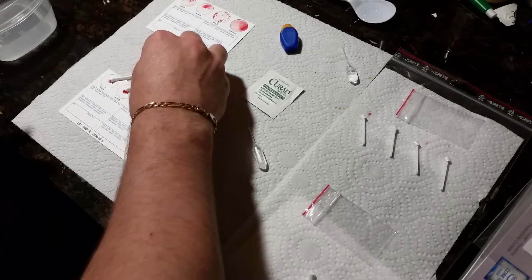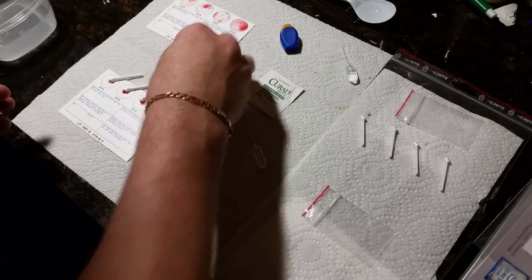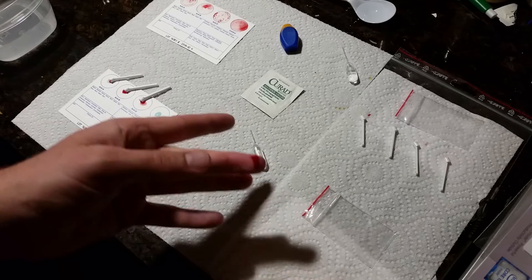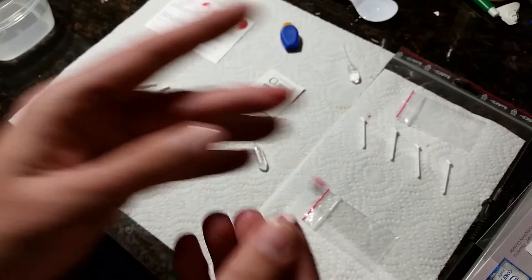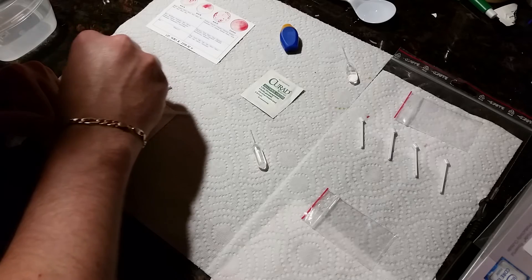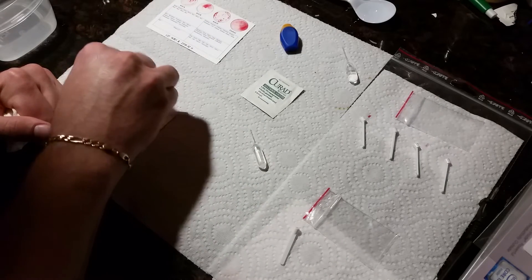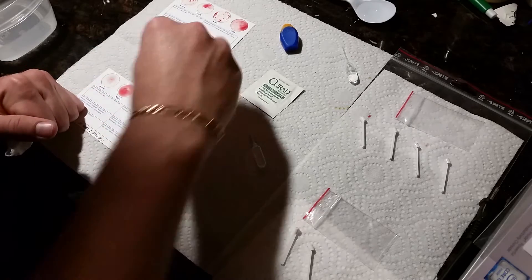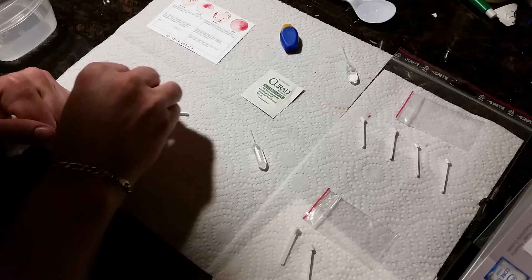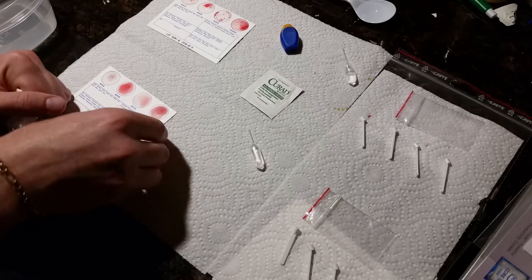Try not to breathe on your surface area, do not cough on your surface area — keep it as clean as possible. This stuff comes out of the bag pretty sterile. Here's the last circle — let me make sure I get this in frame. Squeeze and massage. It's already bunching up just like the first one. The second card should match the first one, and the fourth circle is the control. Make sure you don't contaminate the circles with each other.